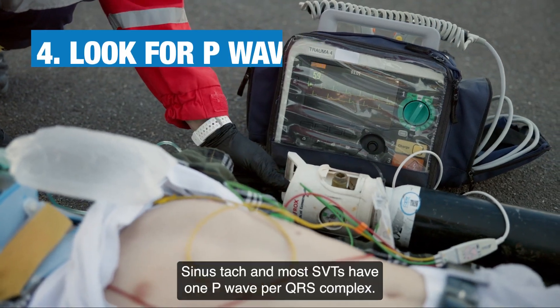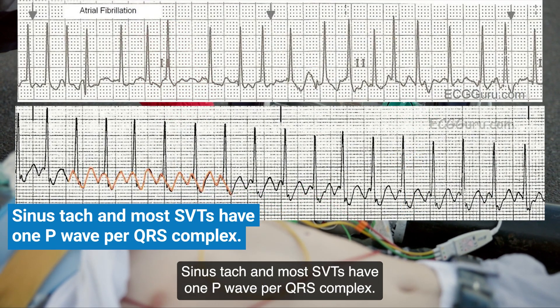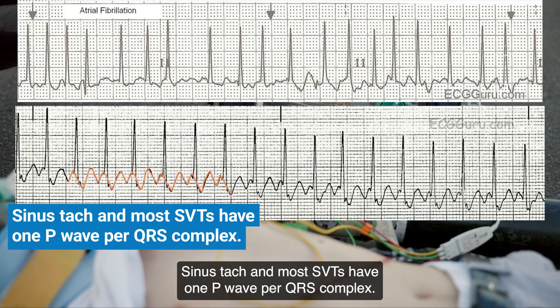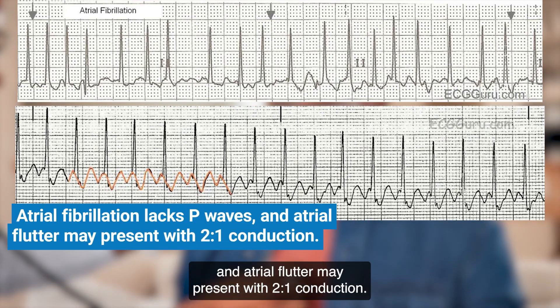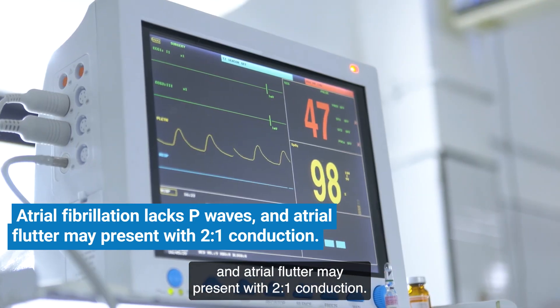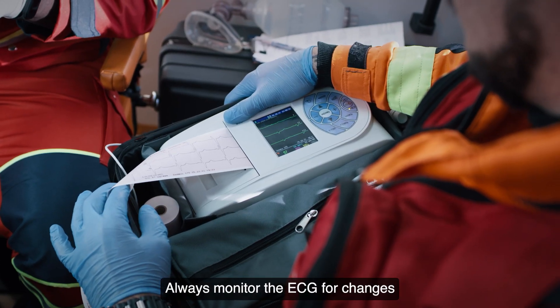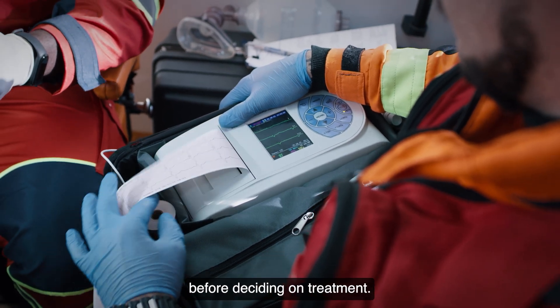Tip 4: Look for P waves. Sinus tach and most SVTs have one P wave per QRS complex. Atrial fibrillation lacks P waves, and atrial flutter may present with 2-to-1 conduction. Always monitor the ECG for changes and consider the patient's overall condition before deciding on treatment.